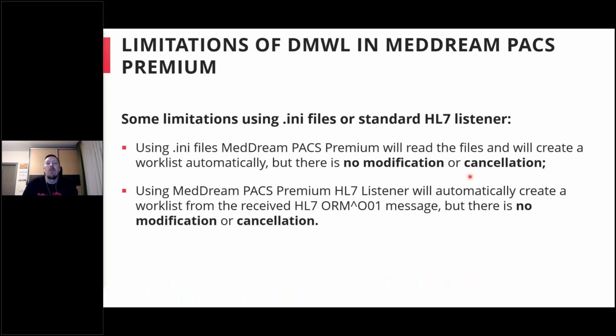And now let's talk a little bit about some limitations of these ways of creating a worklist. Of course, if you didn't have the worklist at all and you will have it, it's better to have a worklist than not to have it at all. But it still has some limitations which I want to cover.